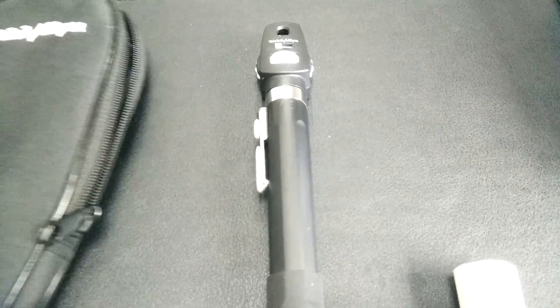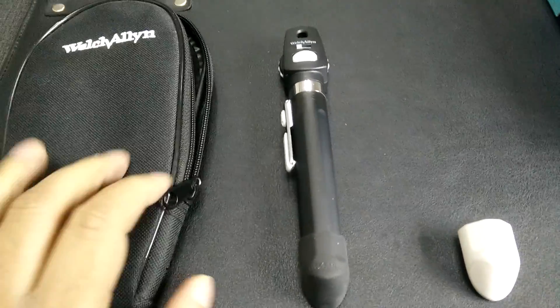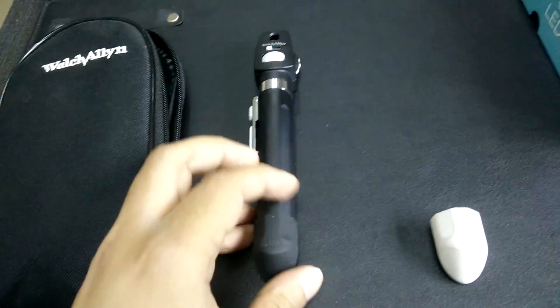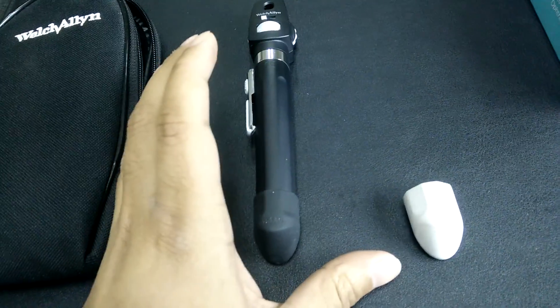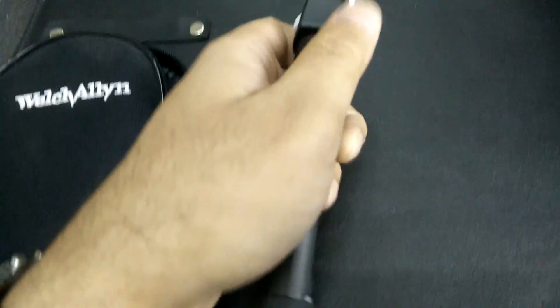And now we are looking into the box to see what are the contents. Here we have a Welch Allyn carry case which is made out of fabric. And we have the actual ophthalmoscope here. The ophthalmoscope comes with two handle bumpers. So now let's look at the ophthalmoscope in detail.